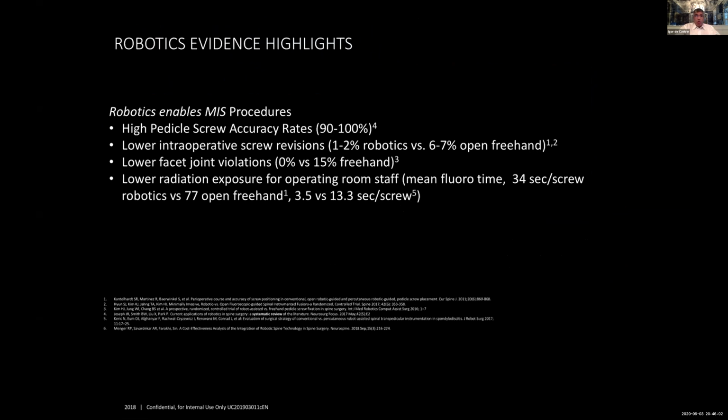So long story short, it has already been talked about: high accuracy with the robot, very good technology. One of the series showed the comparison to freehand. Of course, for some freehand surgeons like Professor Isaac, the robot is against you because he has 0.35. But that's average, and nobody has somebody like him everywhere in their service.